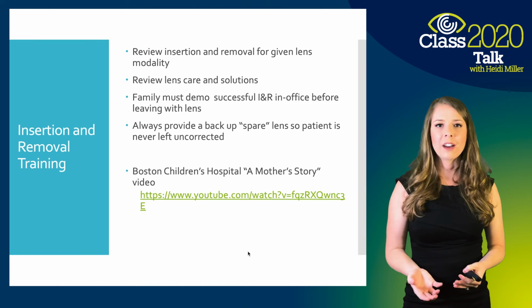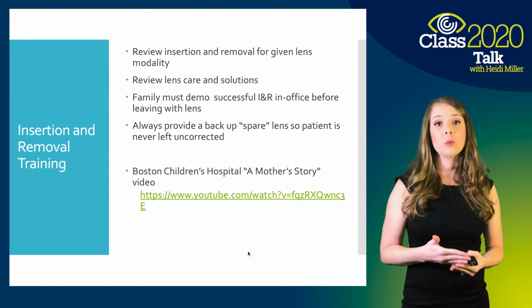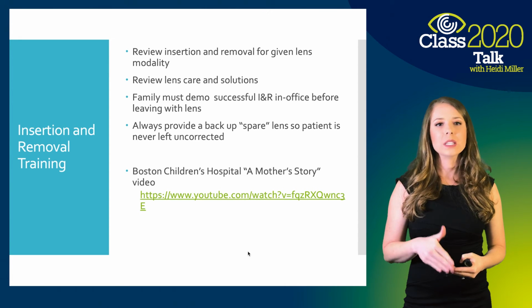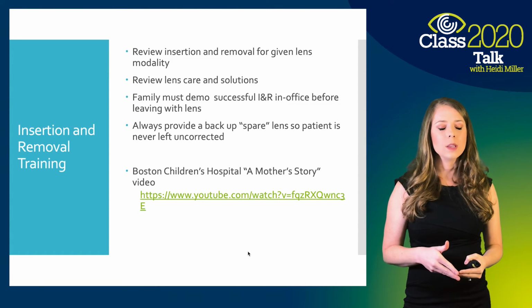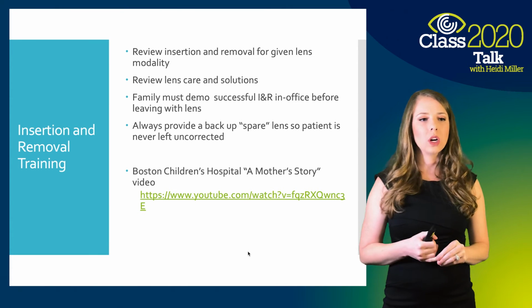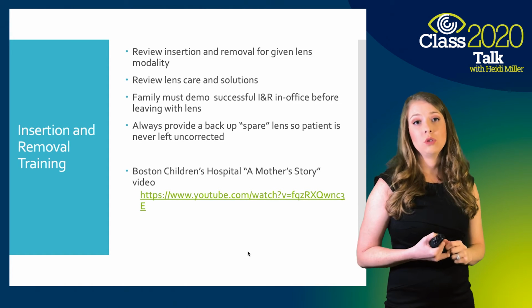And then when the patient comes back for follow-ups, I tend to review those kinds of subject matters, make sure that we're on the same page, that we haven't gotten creative in between follow-ups, and that we're still following what was recommended. So at that initial dispense visit, you want to make sure that you're going over insertion and removal for whatever lens you choose.